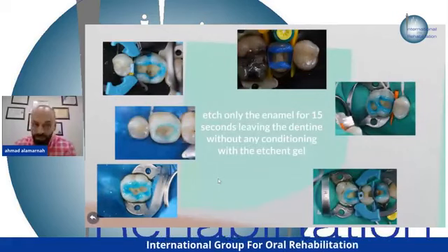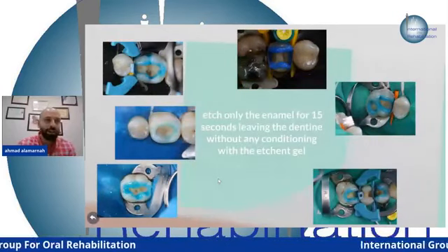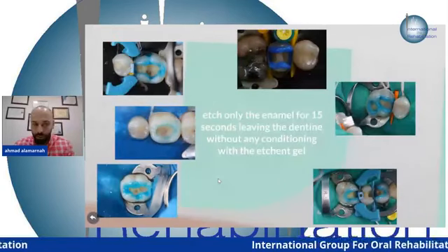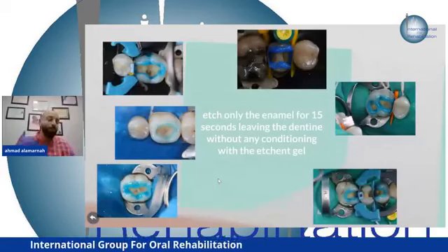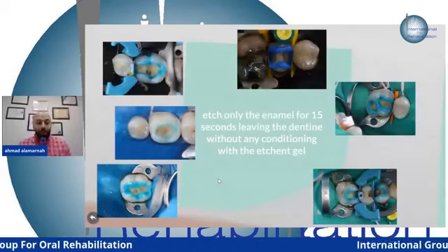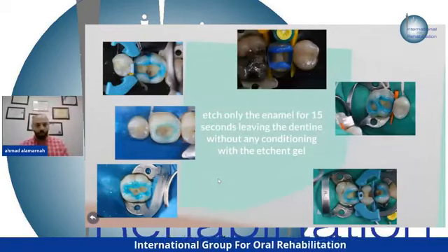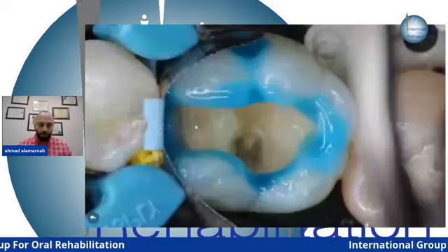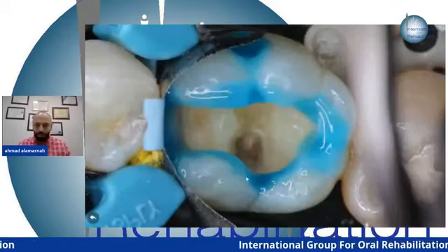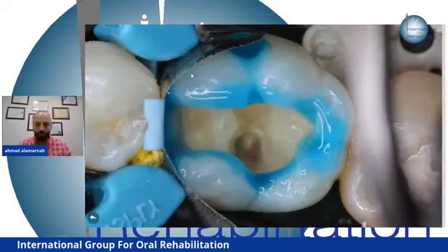How to modify the dentin? By using a bonding system that has etch in it, a weak etch that's going to modify the dentin smear layer, okay? This is the selective etching. Look, I only etch the enamel. Another picture. This is only the enamel.